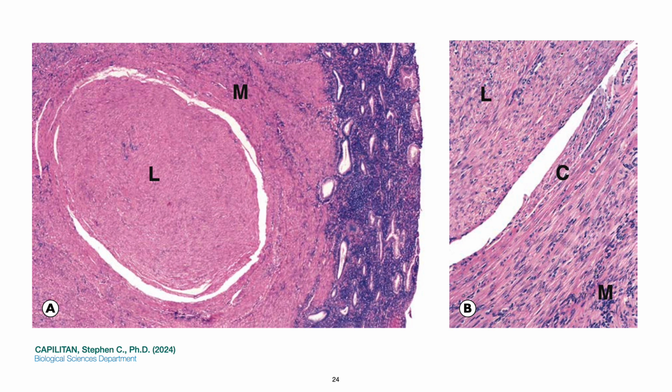Note that the neoplasm is well circumscribed and shows no evidence of local invasion. This neoplasm has expanded symmetrically and compressed the supporting stroma of the myometrium to form a pseudocapsule in letter C.